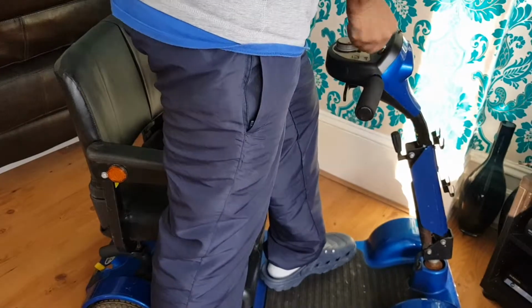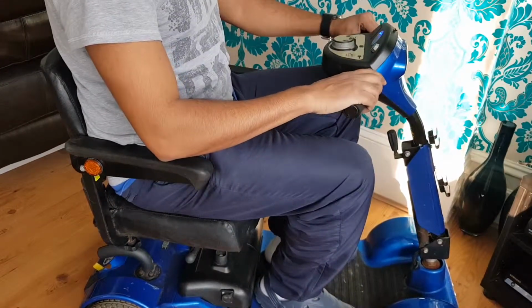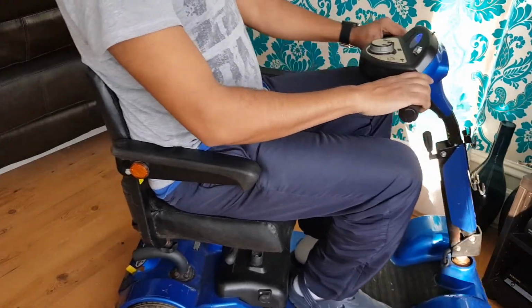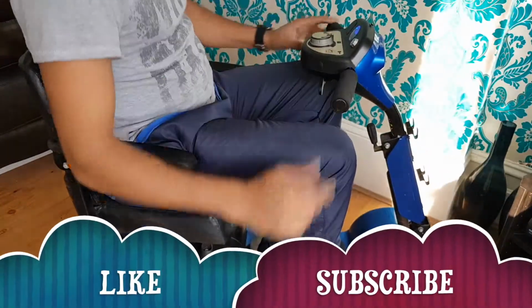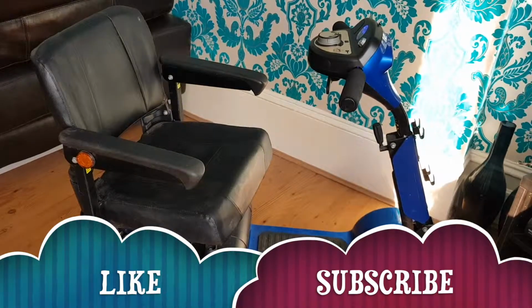And then if I sit down, fire this up. Keys fell out, but yeah, bad boy. Reverse, forward. Done. Okay, that's it. Simple as that. Easy peasy. Not difficult, not hard. Anyone can do it.